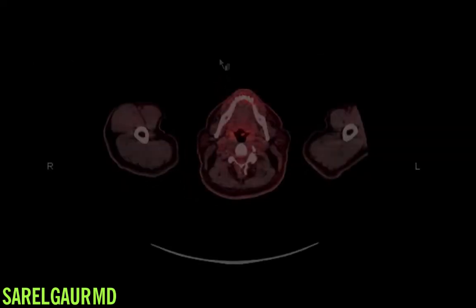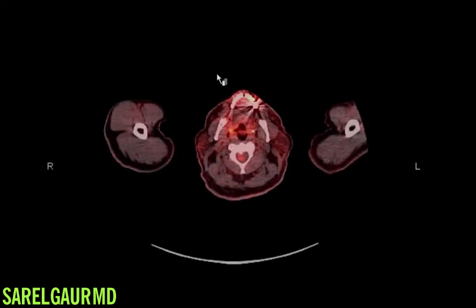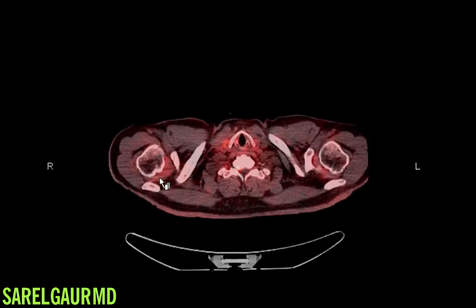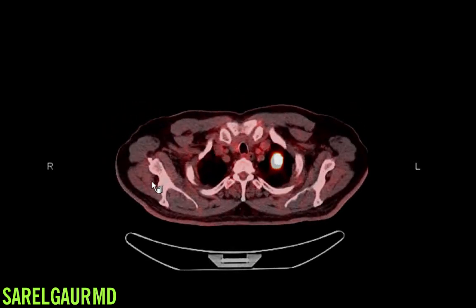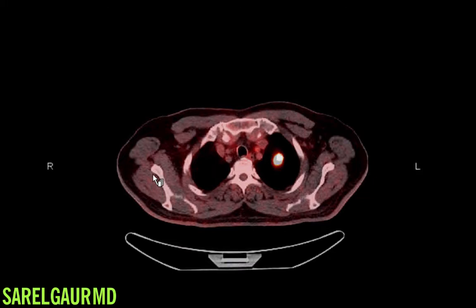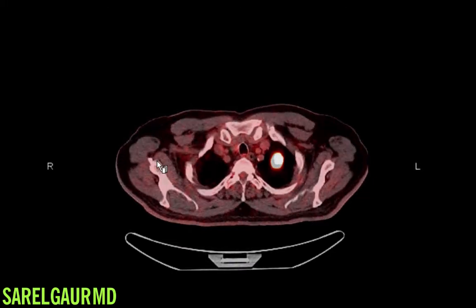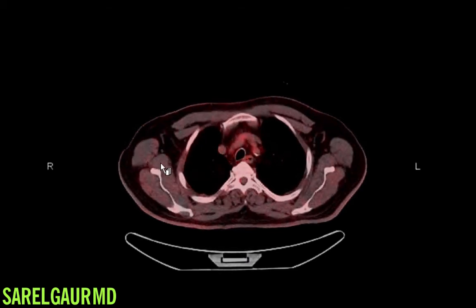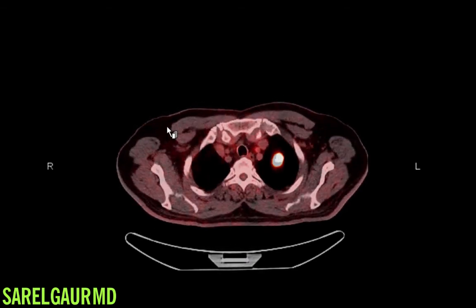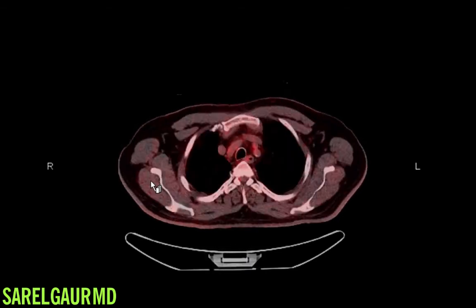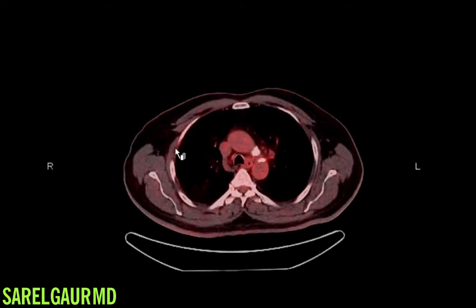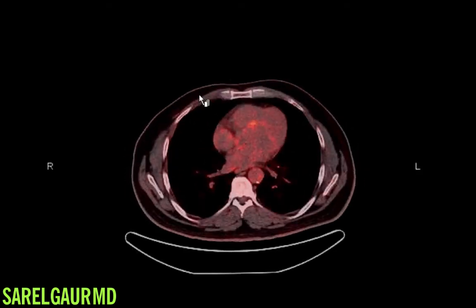Next, I'm going to look at the fused axial images. This fuses the PET data with the CT data. I can see that this nodule is very bright or very orange — it's taking up a lot of the PET agent. This means that this nodule is very hypermetabolic, and this confirms my feeling that this nodule could represent cancer.